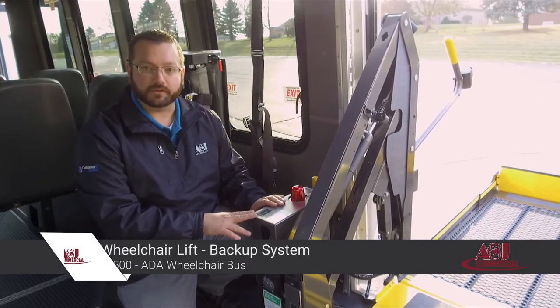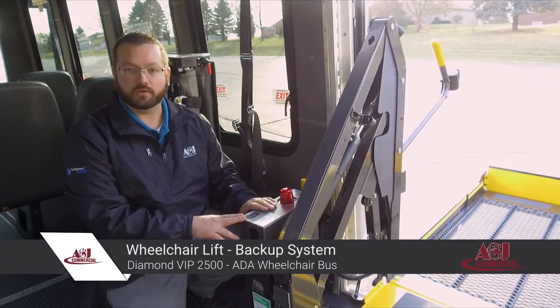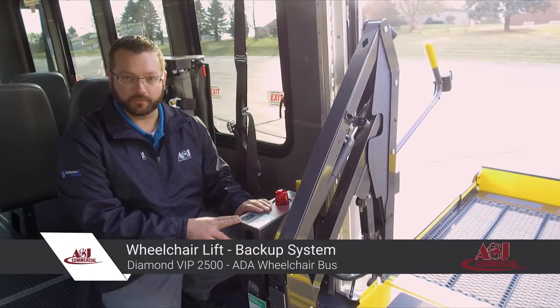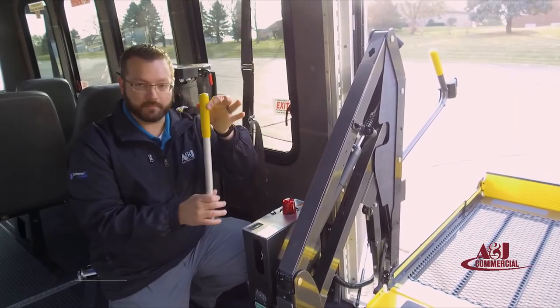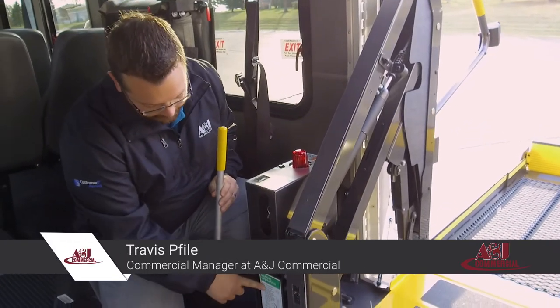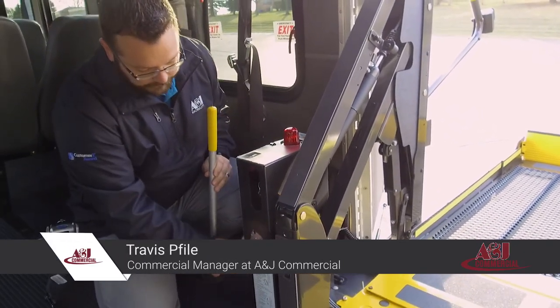Your lift is equipped with a backup system in the event of a power failure and you need to get occupants off the bus. You have a small handle that's hidden right on the back, along with a diagram and instructions on what to do.